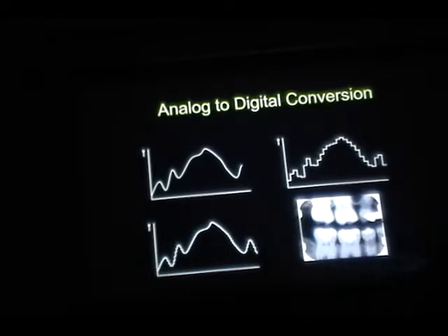Step size? Stepwise. Okay, so basically it's called sampling. So here we are taking too many samples. If you take too many samples, you get a better quality picture. If you take fewer samples like this one, you'll get a poor image like this. So what is the downside? If you take too many samples here, the processing time will be more.